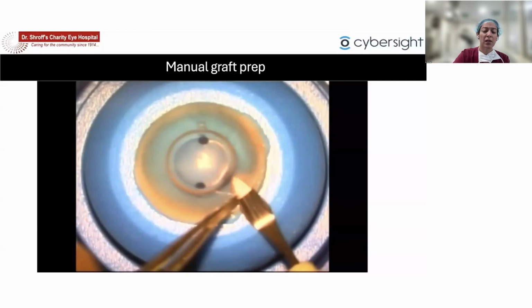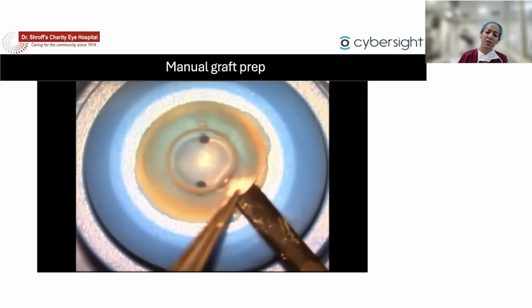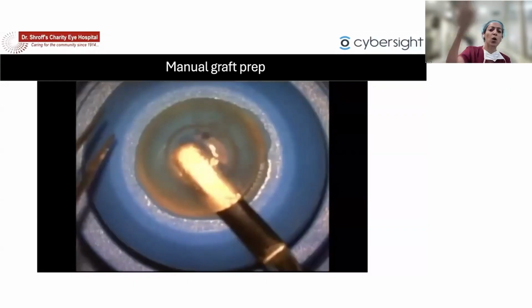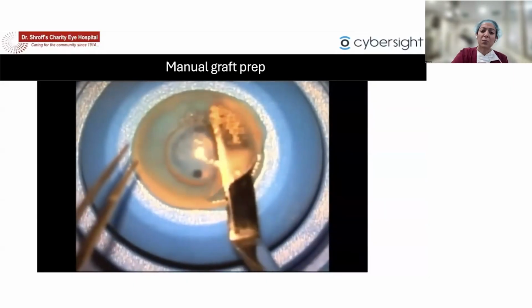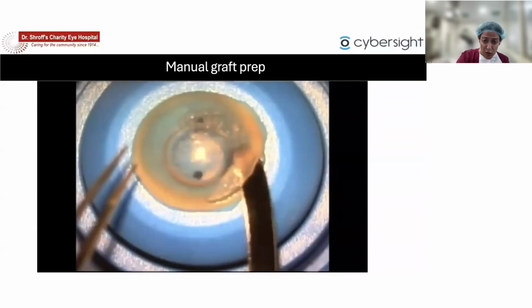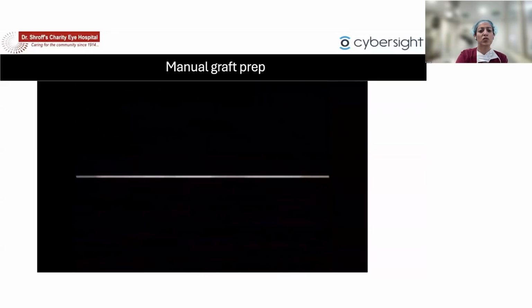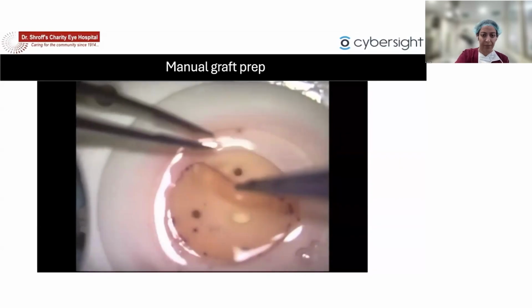cornea. After the initial entry into the cornea, we take lamellar dissectors, which are straight up till mid half of the cornea. And then there are curved dissectors to curve over the half of the cornea and go across up till the opposite limbus and all across to free the entire tissue. After this plane is created, it's important to maintain adequate pressure, release the seal, and snip the tissue. And then it is placed on the Teflon block. And with a suction trephine, the tissue is dissected, marked, and then it is ready for insertion.